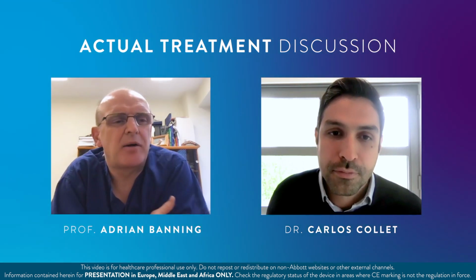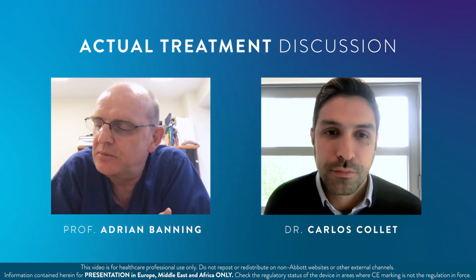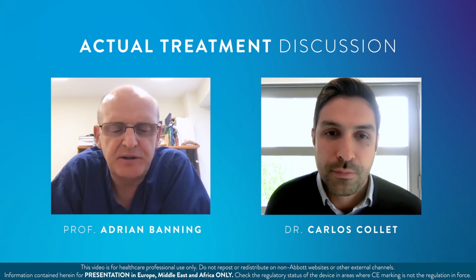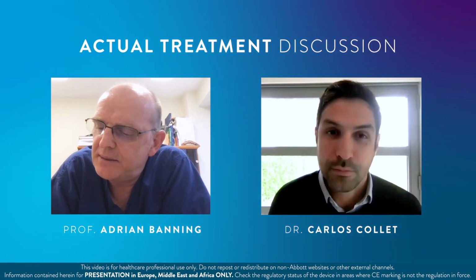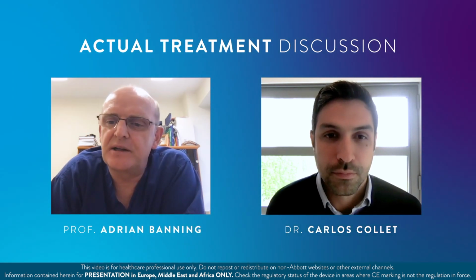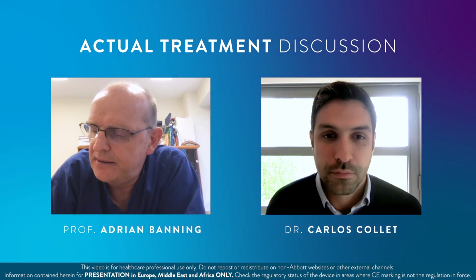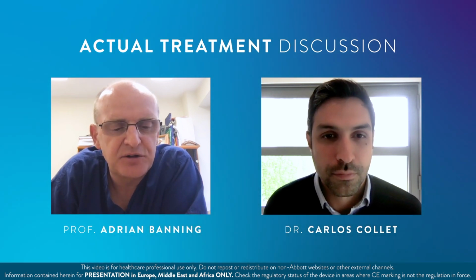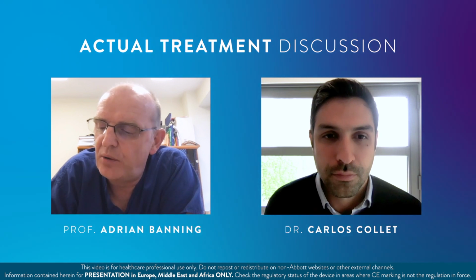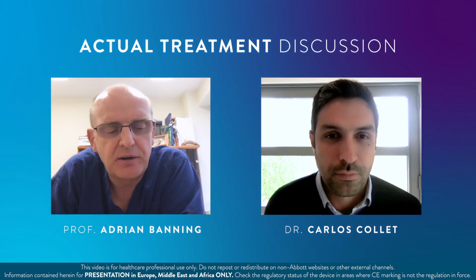And as you say, it doesn't really matter to a certain extent, as long as we get into the distal lumen, and then making sure that we've expanded the area of the bifurcation and the carina optimally. And you obviously got nice images with that. And then making sure that the main branch is right. One of the risks here is that we get our eyes completely transfixed on the ostium of the diagonal, and we forget that making sure that the main branch proximally is optimized is hugely important, and there's lots of good data confirming that statement.